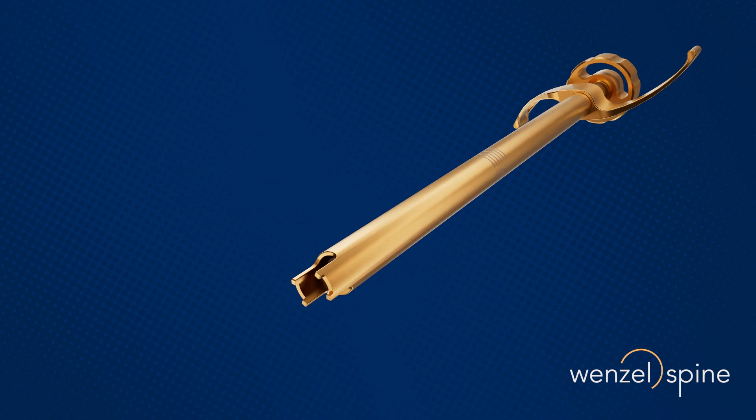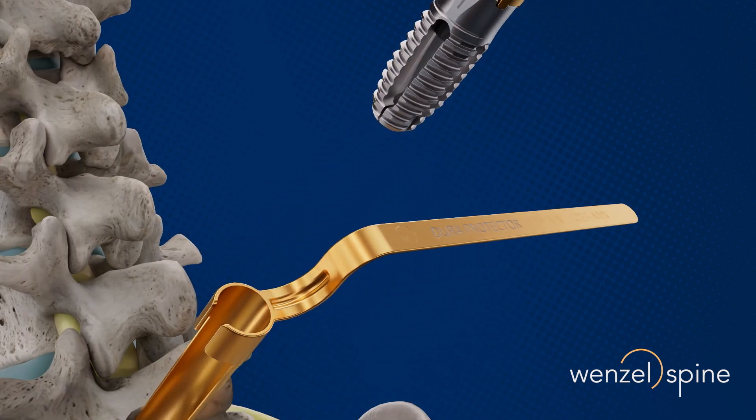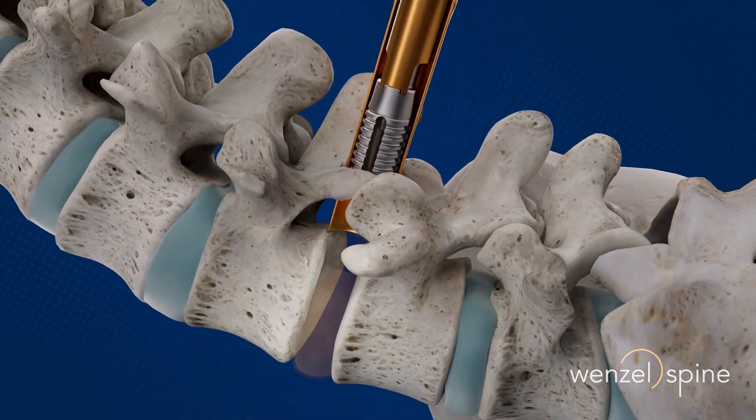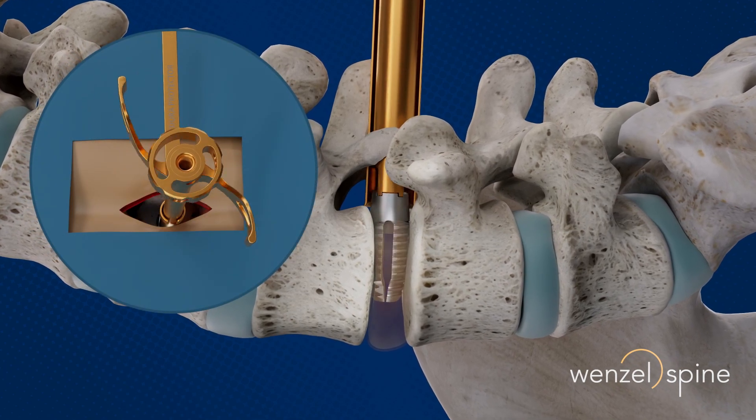Once the optimal implant size has been determined, the implant is loaded onto the inserter with the nerve root and the thecal sac protected. The Verilift device is advanced into the prepared disc space by rotating the inserter handle clockwise.